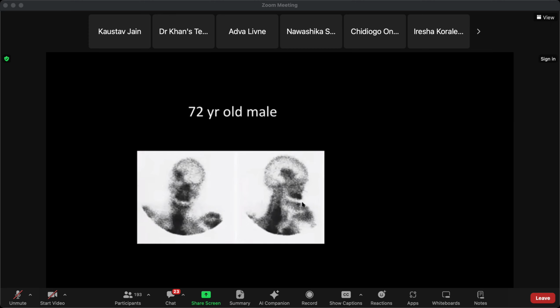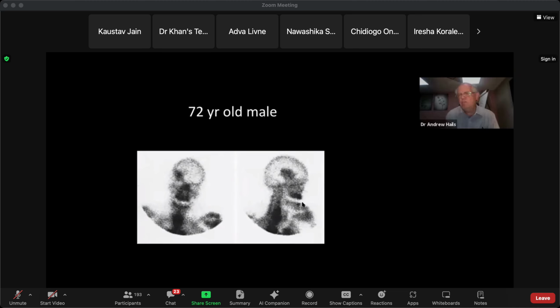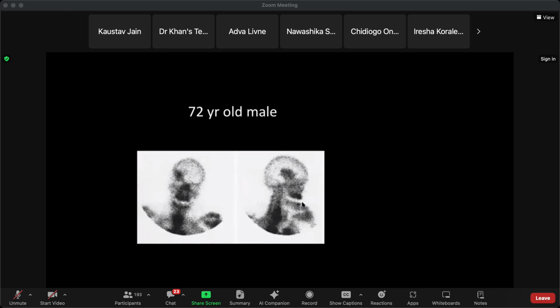So a solitary rounded lesion like that, potentially a plasmacytoma, or, in a 72-year-old, less likely an LCH-like lesion, which would be more for a pediatric patient. Or metastasis. Or Paget, but I think Paget is more diffuse rather than a circular focus, when I've seen it, but it could be.